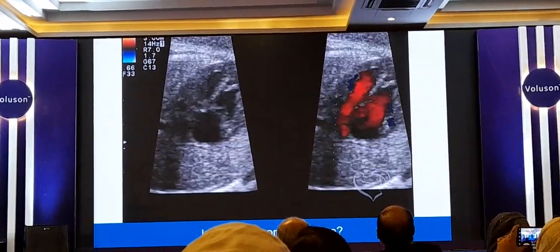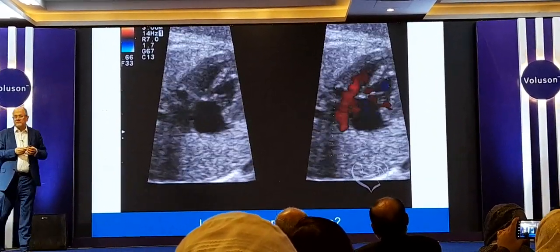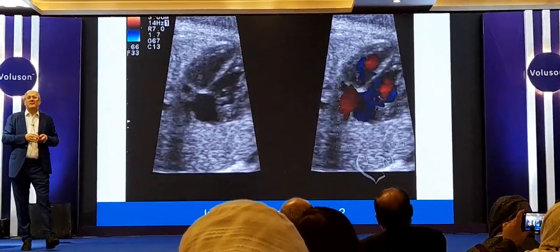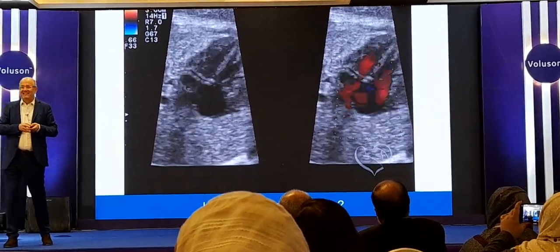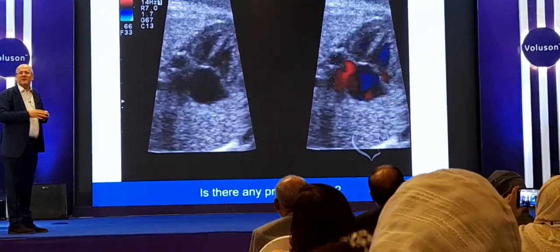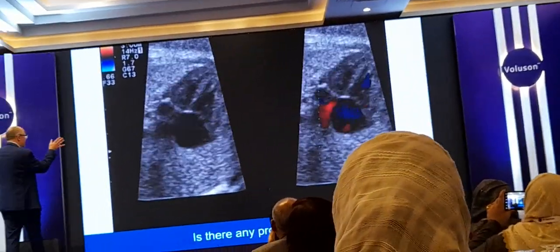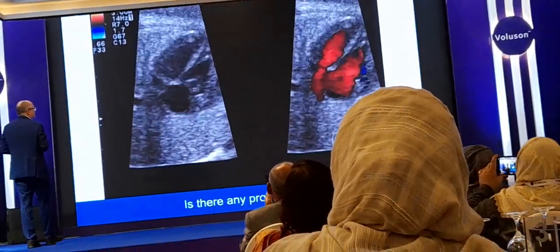Normal, abnormal? You've got a decision to make. Normal, abnormal, or I want more information? We've got normal. Because some people are asking for more information. I would go for more information. Maybe let's take a slightly different view, okay?